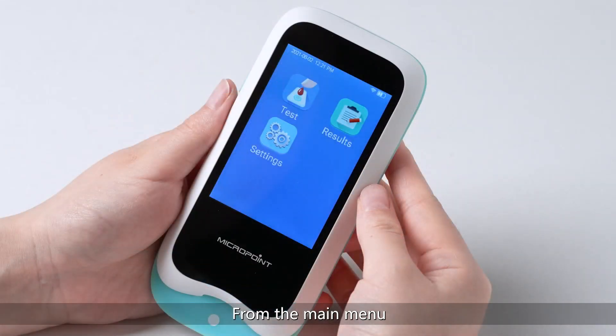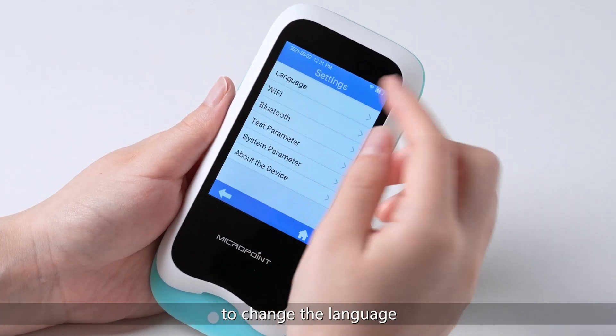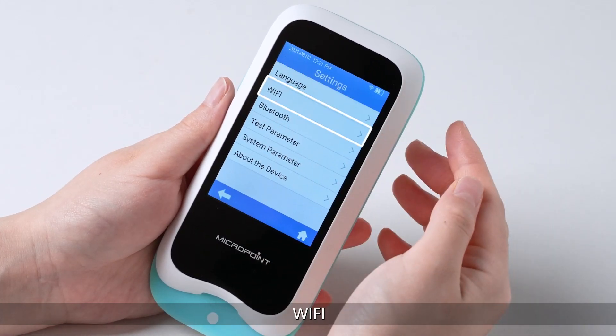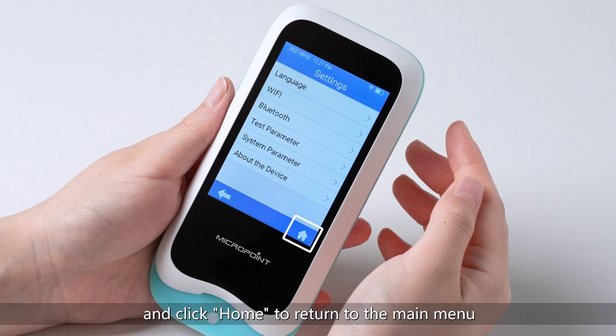From the main menu, you can see 3 icons: Test, Results, and Settings. Click the Settings icon from the main menu to change the language, Wi-Fi, Bluetooth, Test parameter, or System parameter. Click backward to return to the previous menu and click home to return to the main menu.